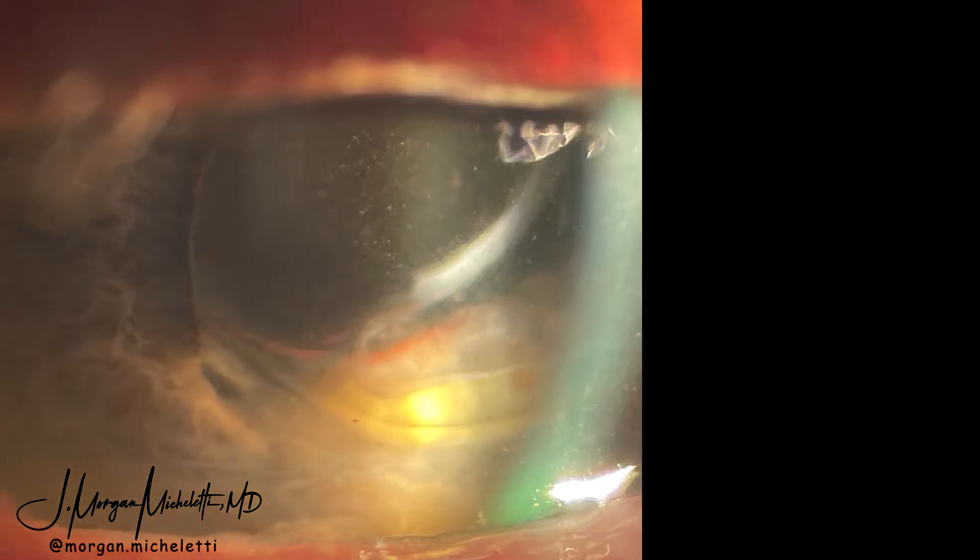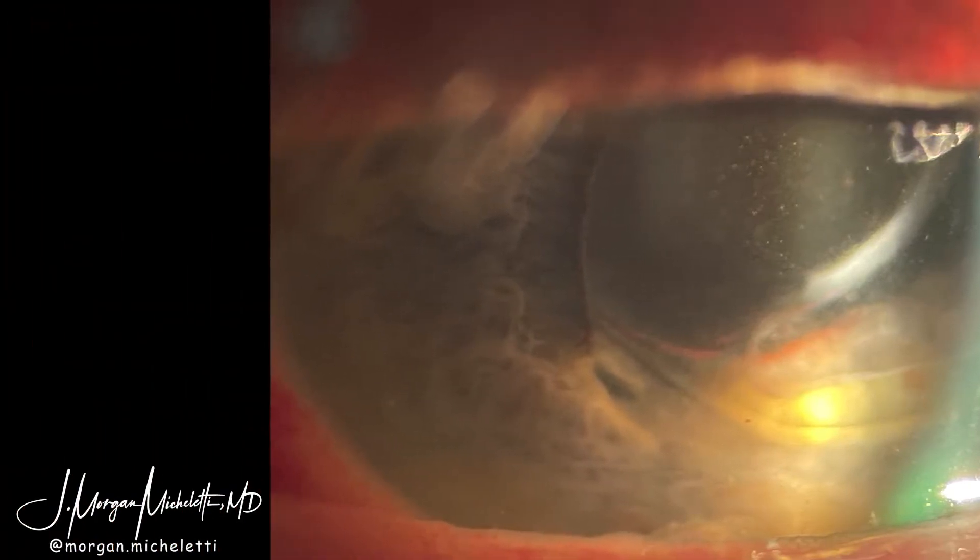This is a patient who presented after an anterior dislocation of her Restore lens that had initially been placed back in 2014. She was happy with her lens and so the decision was made to attempt to salvage it.